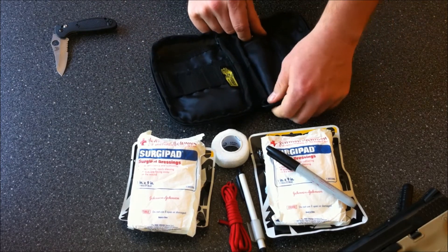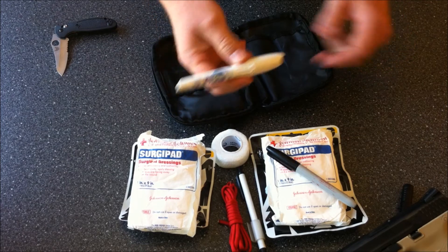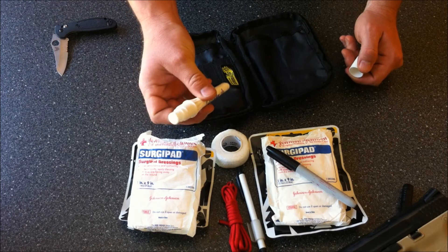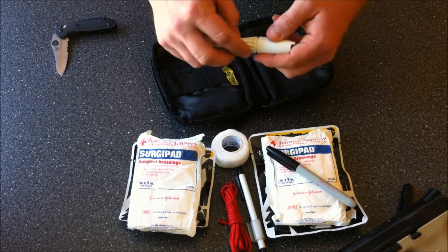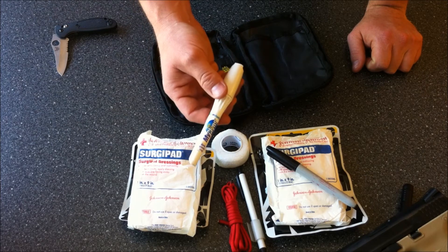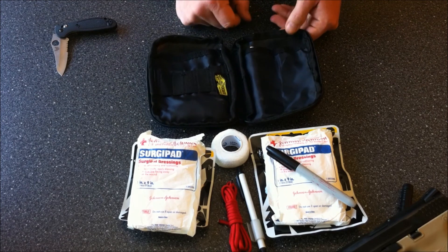We offer courses here at Seer Training in San Jose. The only other thing I keep with me is this My Cleanse, which is a cleaning spray. These have expiration dates as well, but you can pick them up on Amazon and eBay. They're a pump spray that kills viruses, bacteria, and similar things. They're used in hospital settings by nurses, doctors, correctional settings for gassings, law enforcement, medics, EMTs, and fire.